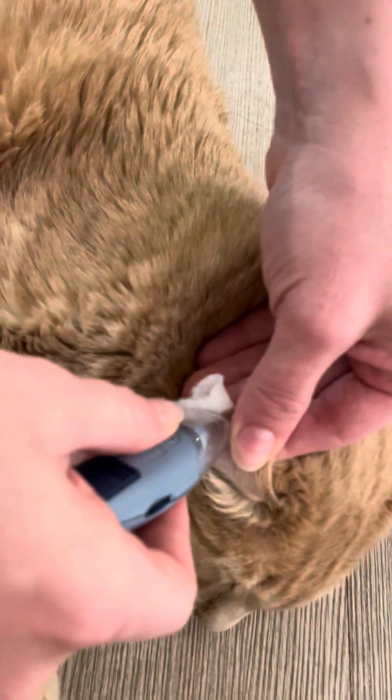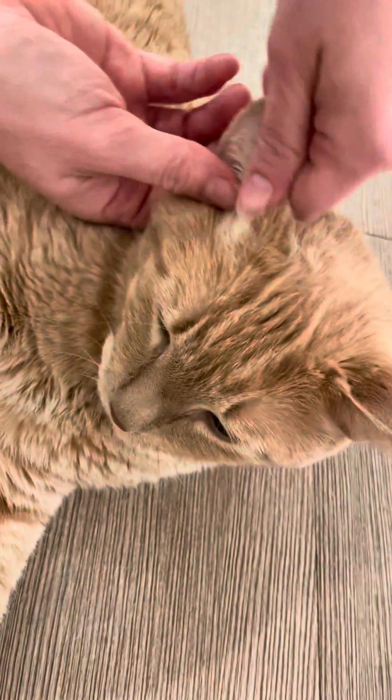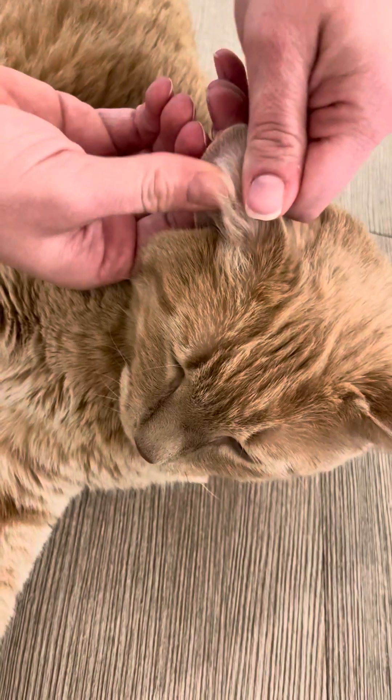I take a little piece of paper towel so I don't also get the needle in my finger. Take the edge and press the button. Usually there's no blood that comes out — you have to do a little squeeze.